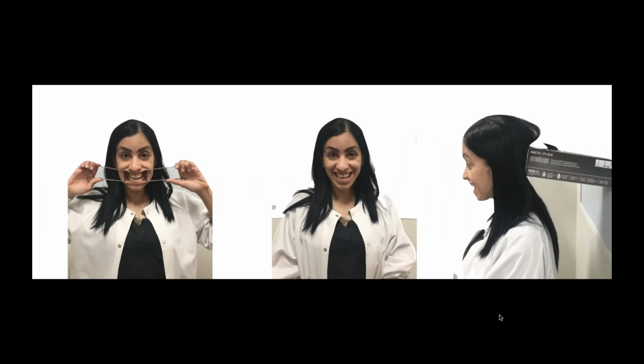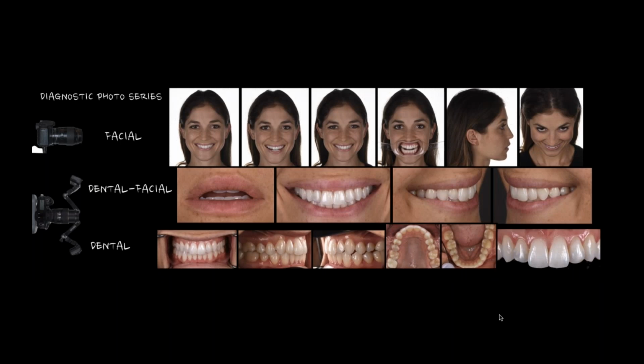When I'm doing that, I've always explained that I want the patient either sitting or standing against the wall. For those patients who move a lot, the trick we've taught many times over the years is to put a little glove box or something behind their head so the head is a little bit more stable. Then it's easier to take a consistent row of photographs as you go through. These are my basic headshot photos.